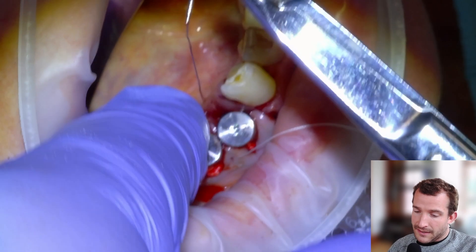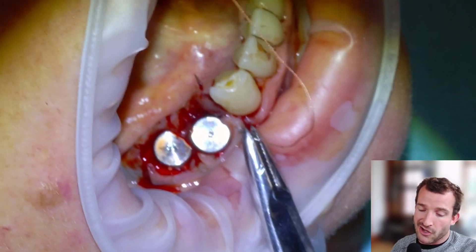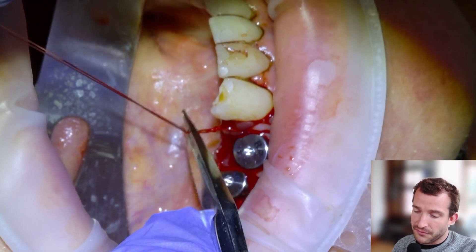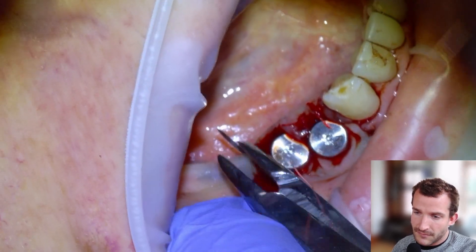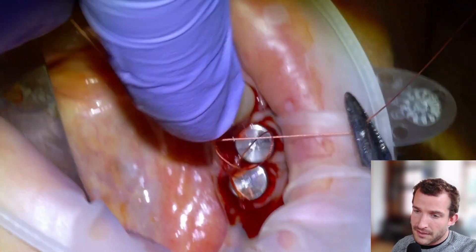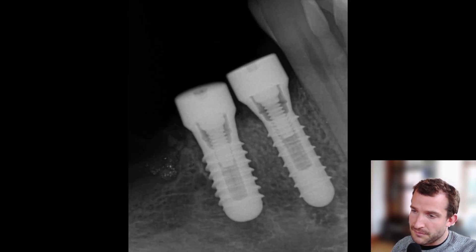I like to leave my allograft material dry in the carrier, because if I hydrate it before I put it in the carrier it clogs and you can't push it out. As long as you rinse it with saline thoroughly before placing it in the site, it's going to rehydrate with blood in vivo. We'll put a couple sutures in and then send the patient home with some Advil and Tylenol, and make an appointment three months down the road. There's the PA of the post-surgical phase.